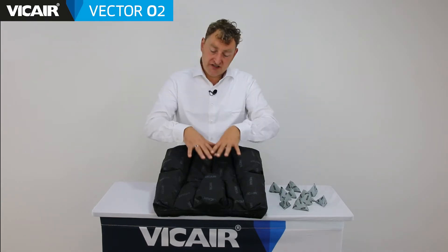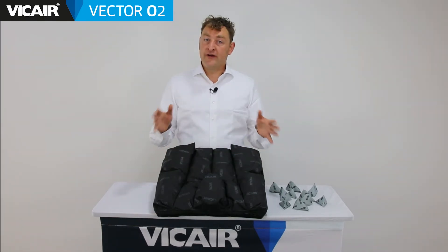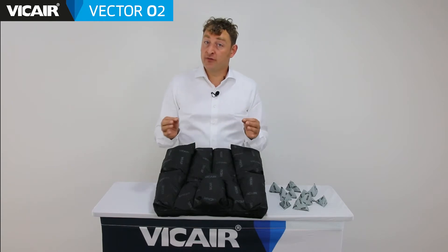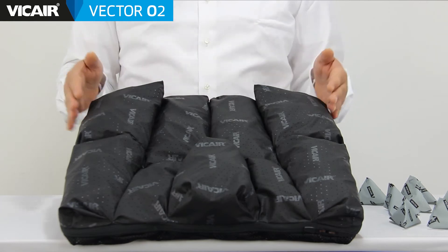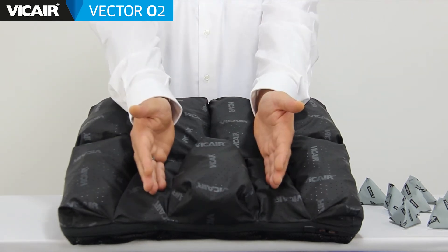The Vicair Vector O2 is a pre-contoured cushion which consists of nine compartments. Pre-contoured means that the cushion already has an outline of the shape of the body before it's loaded. Each compartment is designed to influence a specific area of the pelvis, striking a unique balance between preserving skin by redistributing pressure at the ischial and coccyx area, stabilizing the pelvis and positioning the femurs.